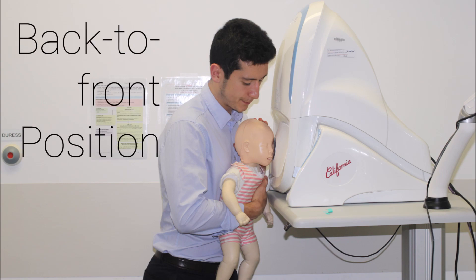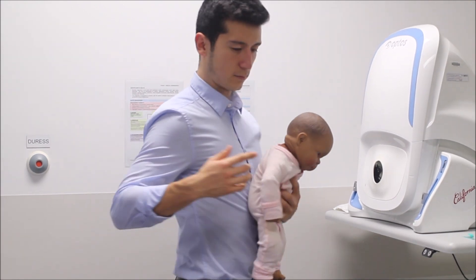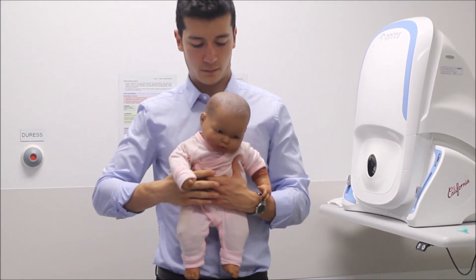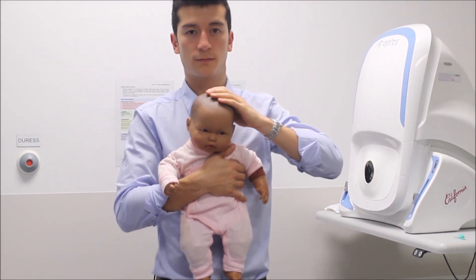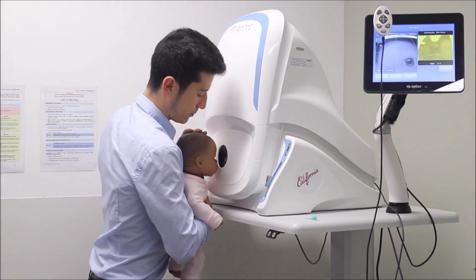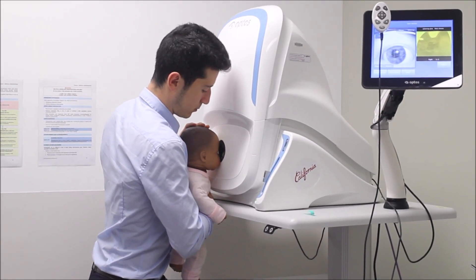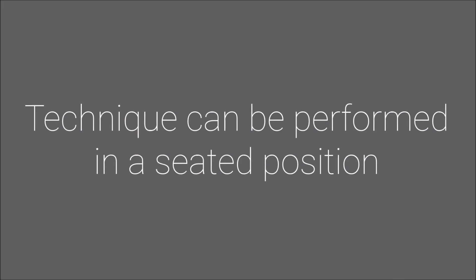Back to front position — particularly useful in slightly older babies. Tuck your dominant arm underneath the baby's arm and into the contralateral armpit. Use the other hand to support the head. Maneuver the baby towards the camera's aperture whilst the imaging technician captures the photos. The technique can also be performed in a seated position.